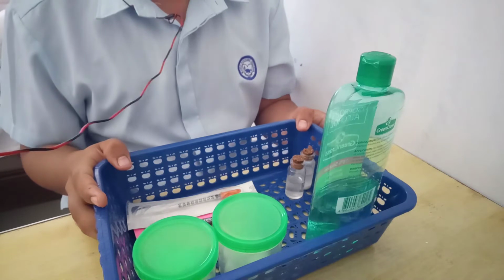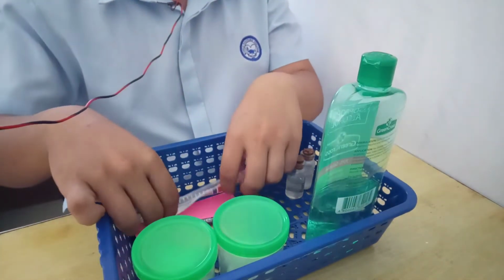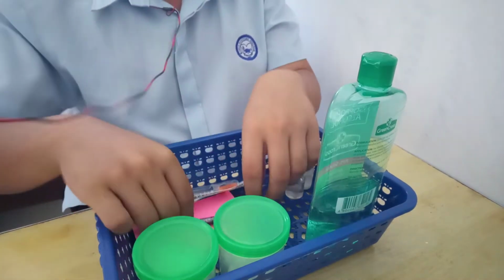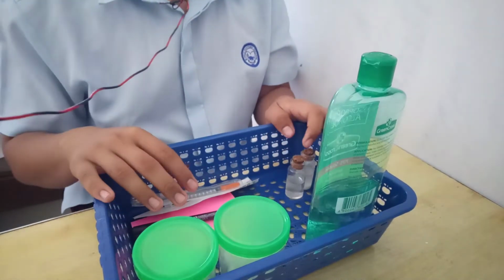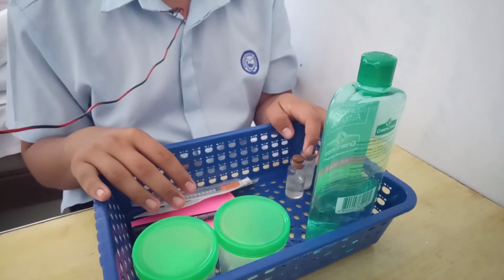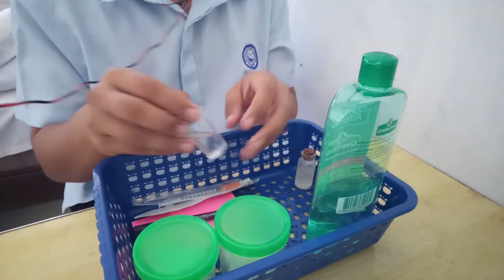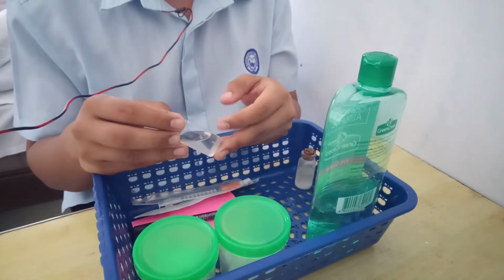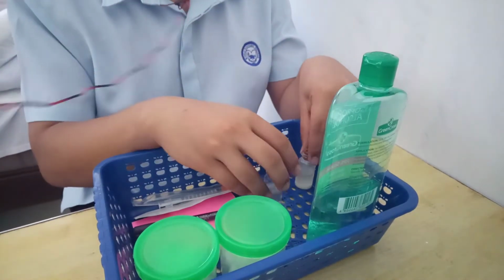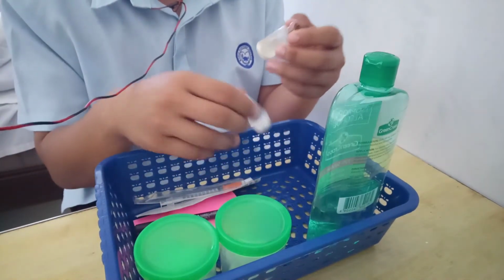Next, gather the equipment. So we have the alcohol, wet cotton balls, dry cotton balls, insulin syringe, and paper and pen for labeling. And also, we must prepare the insulin vials that are to be administered to the patient. So we have a clear insulin for the short acting and then the cloudy for the long acting. Next is check its expiration date.